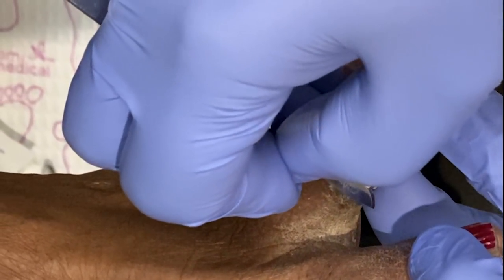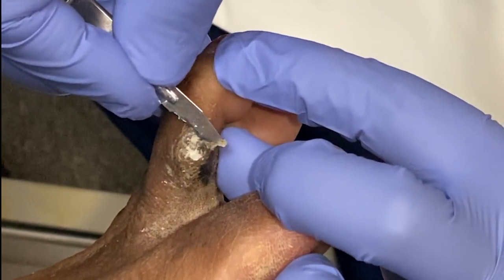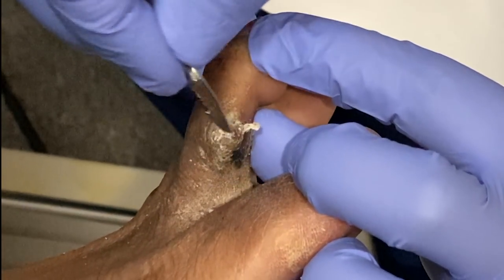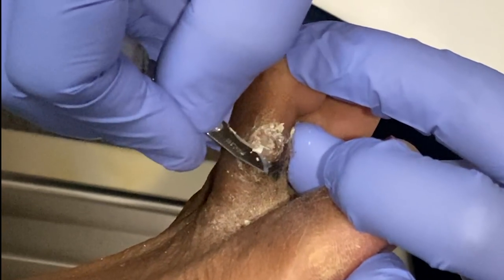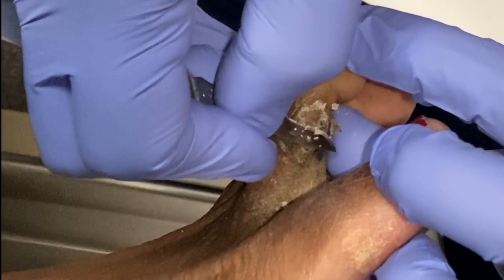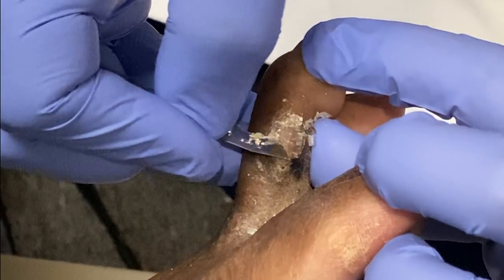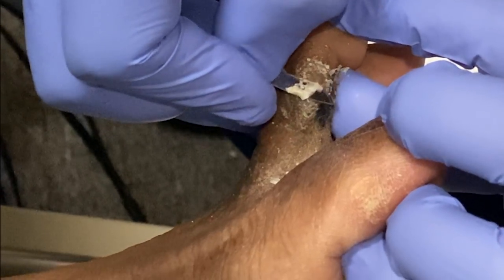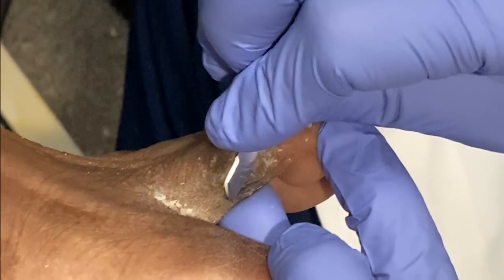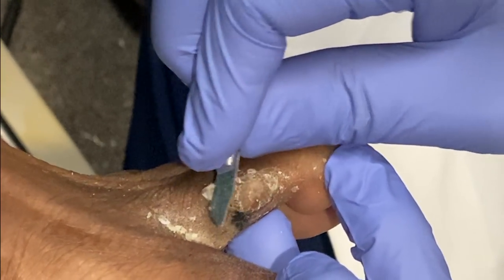This patient came to me after she had problems with her toe. She had a prior hammer toe surgery on this same toe, and what she ended up having was a fusion of the toe joint, which is a common procedure for hammer toes. She started developing this knot on the side of her toe. The prior doctor had given her antibiotics — she did fine as far as any infection — but she kept developing this very painful knot on the side of her second toe. I looked at it and basically took off most of the top part of that skin. Here you can see me shaving down most of this hard callus skin. I'm using a number 15 surgical blade.